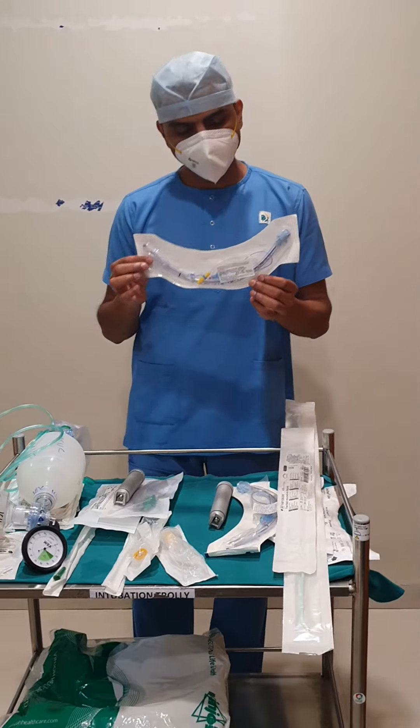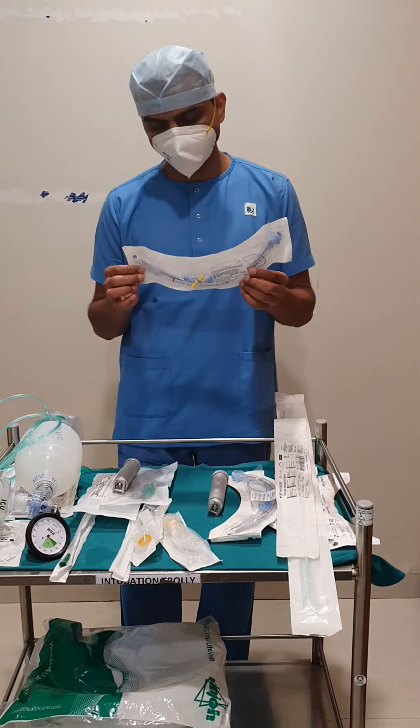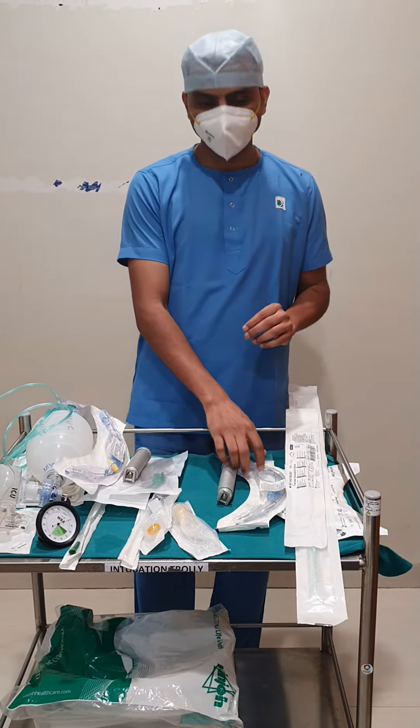This is an endotracheal tube. Usually, for females we will be using size 6.5 to 7.5, and for males it is 8 to 8.5.